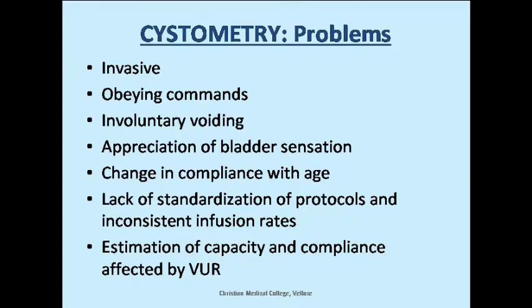We in fact had a case reported in the Indian Journal of Urology where they were doing a urodynamics and they didn't realize they infused a large amount of fluid and they were not understanding why it's happening, and it ruptured. So, this was a non-video study. I guess it would never have happened if somebody would have done a video study, but they did not look into this issue. So it's very, very important.